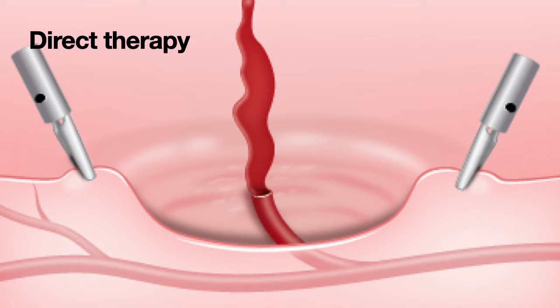First, they can identify the bleeding much faster, and if they are in doubt and the bleeding has stopped by the time they did an angiogram, these clips could help them direct their coil embolization.